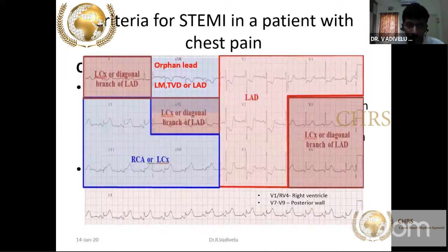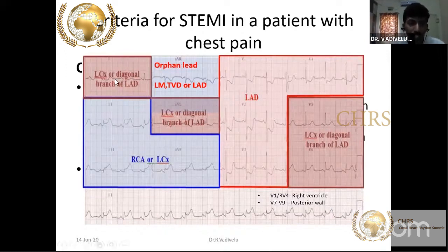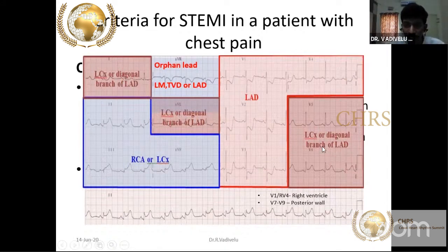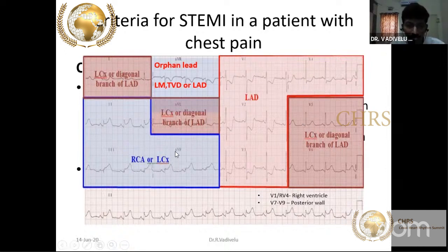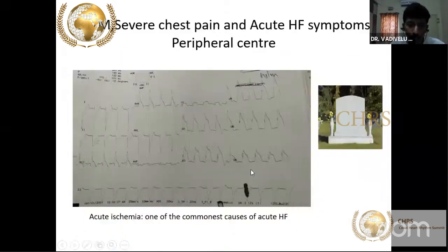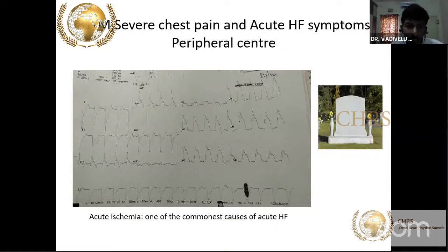A common ECG pattern: LAD or diagonal occlusion. The diagonal, a branch of the LAD, can produce lateral wall MI seen in lead 1, AVL, V5, V6. Anterior wall MI is seen in V1–V4. Inferior wall MI due to RCA or LCX shows changes in leads 2, 3, AVF. Now I will show real patient examples for better understanding. This is an 81-year-old male doctor with severe chest pain living in the hills, who came to a nearby town.